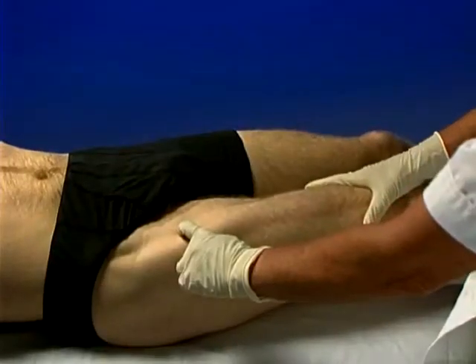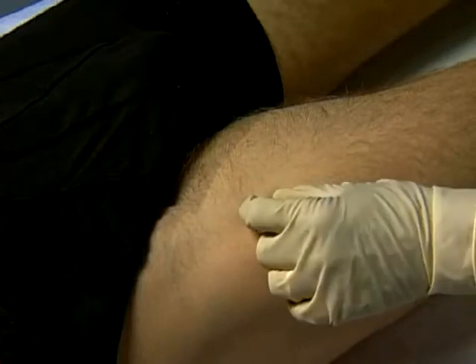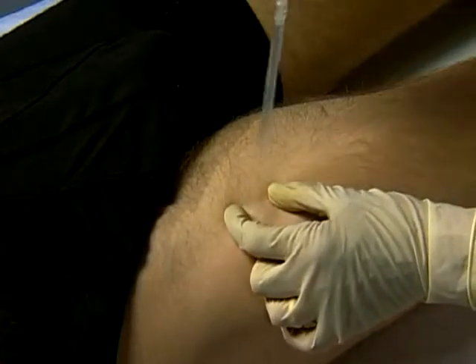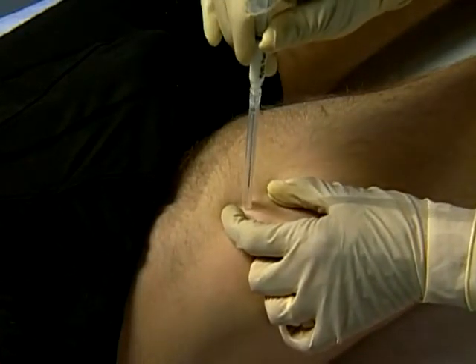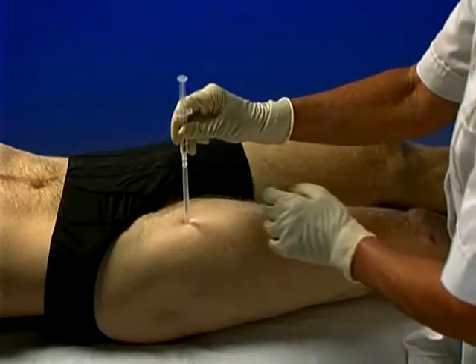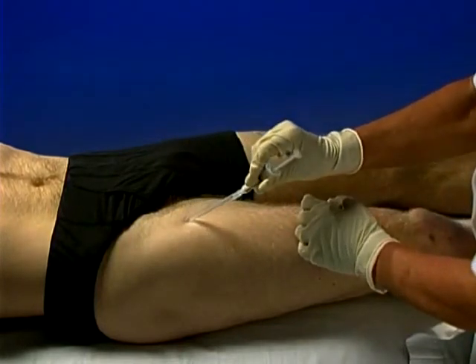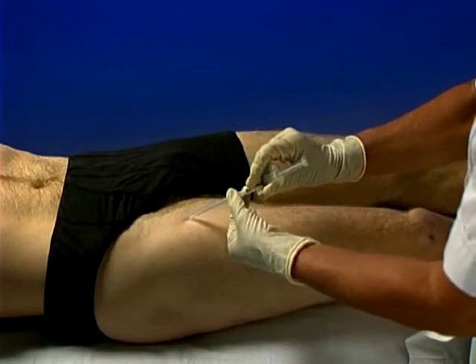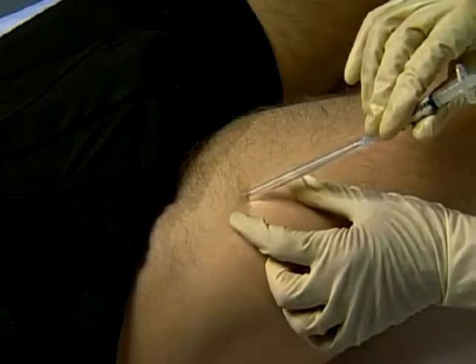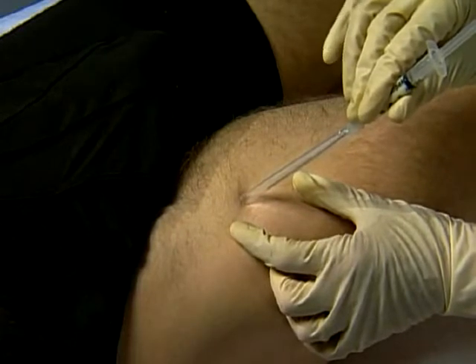Clean and firmly stretch the skin and rapidly insert a 3 to 4 inch spinal needle perpendicularly. Angle the end of the syringe 45 degrees laterally and 45 degrees distally, and pass needle slowly down to gently touch neck of femur. Withdraw slightly, aspirate and inject as a bolus.